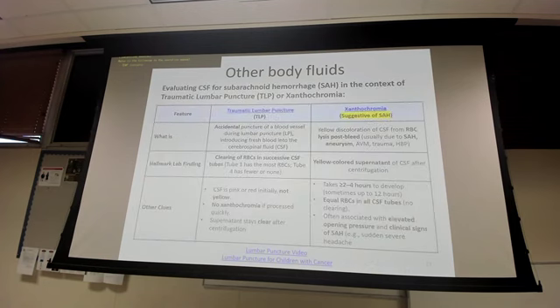All right, and so to tell the difference between an actual traumatic lumbar puncture versus xanthochromia, here's the breakdown. Anytime you're collecting your CSF, you want to ensure that you're providing 4 tubes. Each of those tubes has to have 10 drops of CSF each for approximately 0.5 mLs.